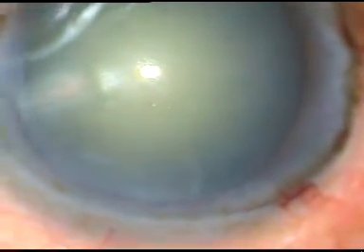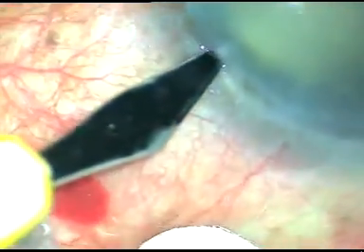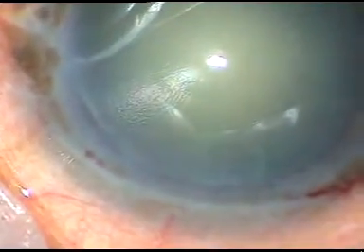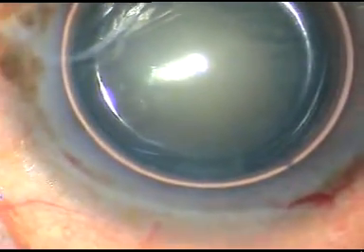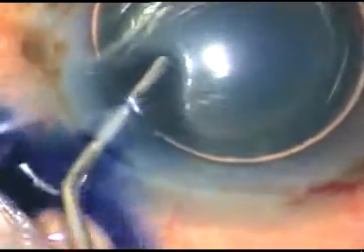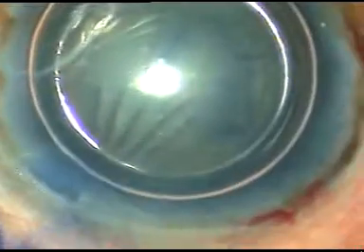The case has been started. All the main incision and both the side ports have been made. Now I am going to stain the capsule with trypan blue dye so that I can demonstrate capsulorrhexis very clearly. This is trypan blue dye 0.06%.